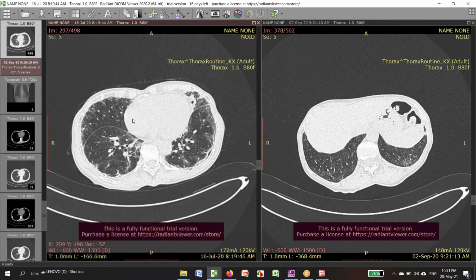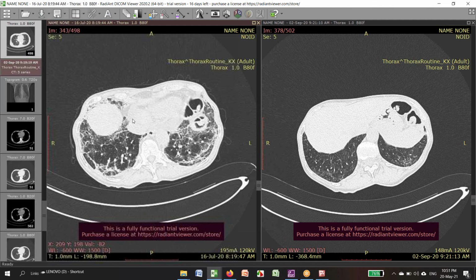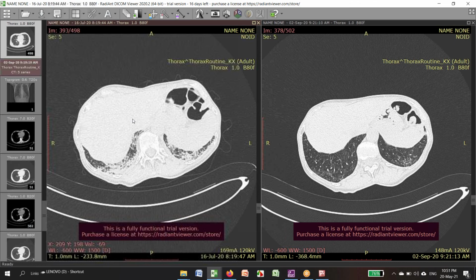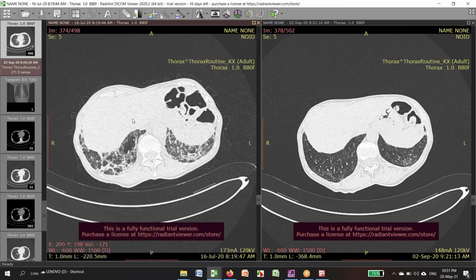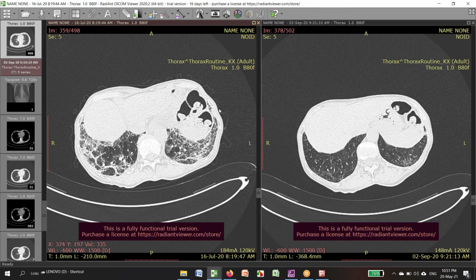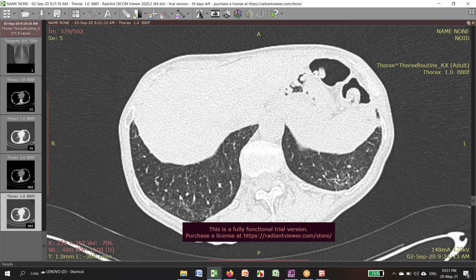Agreed. Yeah, the perilobular thickening is really nice. Now, I have seen cases where you have mixed patterns of organizing pneumonia and nonspecific interstitial pneumonia. And with treatment, a lot of times the OP goes away, the denser stuff. But even her follow-up scan is a little abnormal. It's hard to know how much of that's permanent. Yeah. There is some stuff left, I think, in the extreme bases.